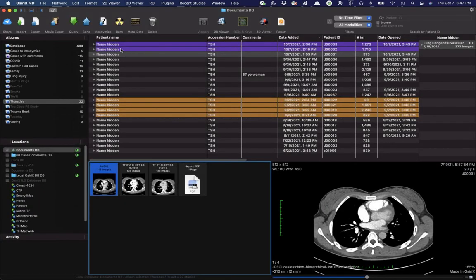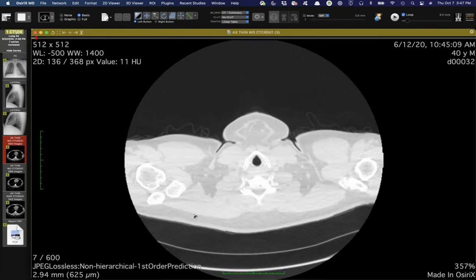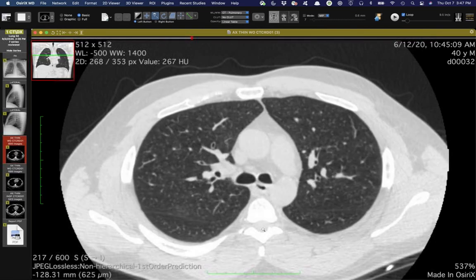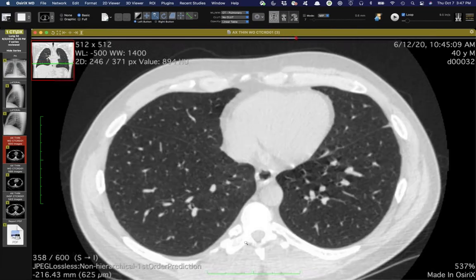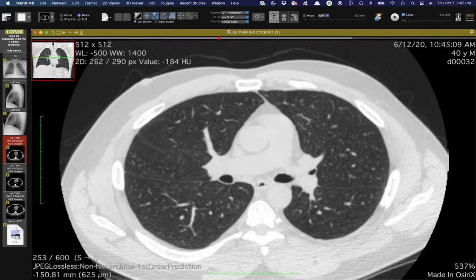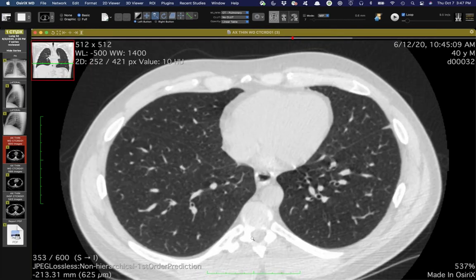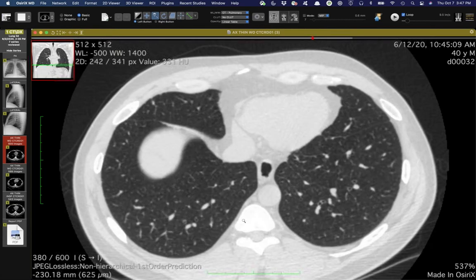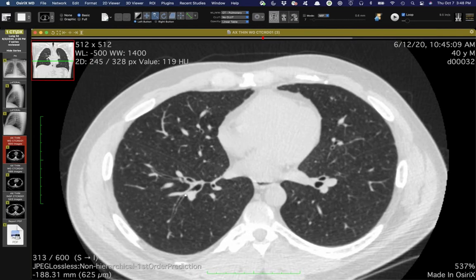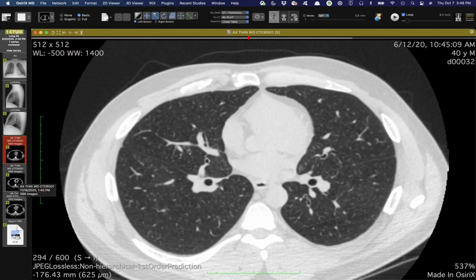Let me show one more really quick, and Seth, you'll like this. I'll go straight to the CT. This is last summer, a 40-year-old guy with cough and fever to 103, during the pandemic. There are diffuse centrilobular nodules everywhere, involving every single secondary pulmonary lobule. His right heart and pulmonary artery are normal, and he's not injecting. The pulmonologist learned he had vaped a couple of years ago but not since, so they couldn't figure out what this was. They thought it was an exposure; somebody said infection, and they gave him azithromycin. We all agree most infections don't cause diffuse centrilobular nodules like this.